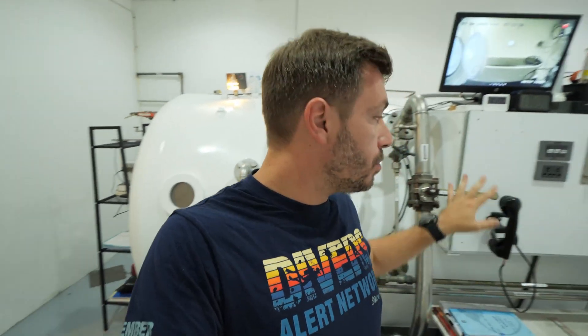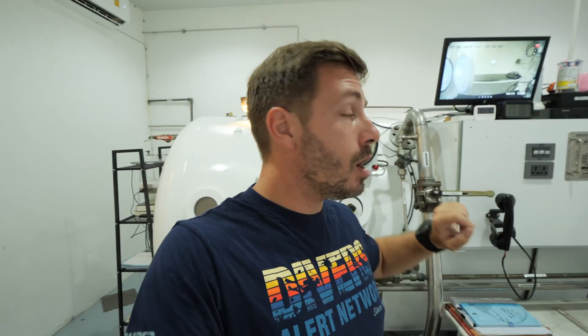The minimum number of people required for a treatment are: a doctor, because this is a medical procedure that must be supervised; a chamber supervisor; an operator; and a tender. The operator runs the machine, the supervisor ensures everything goes smoothly, and the tender performs the entire treatment inside the chamber with the patient.